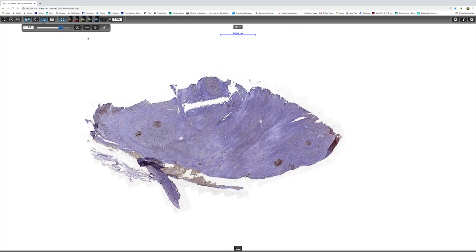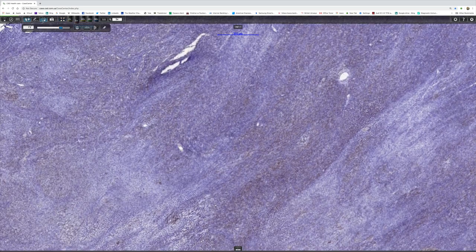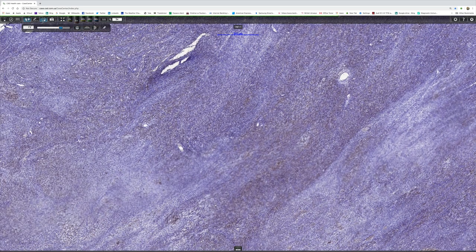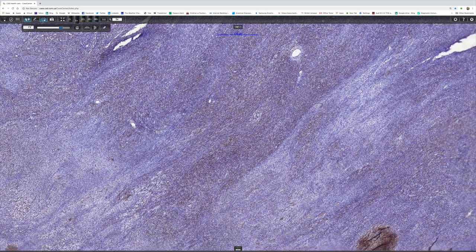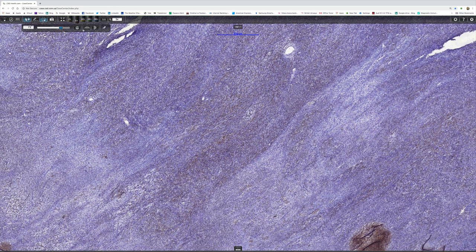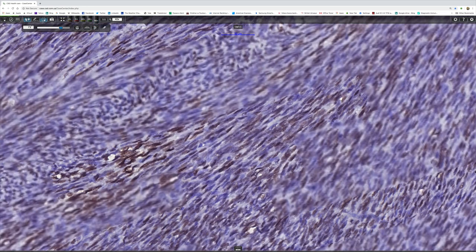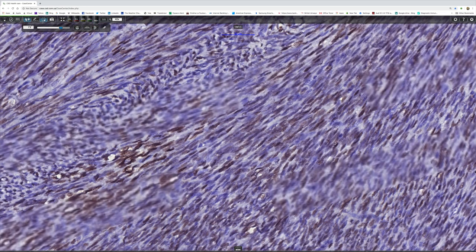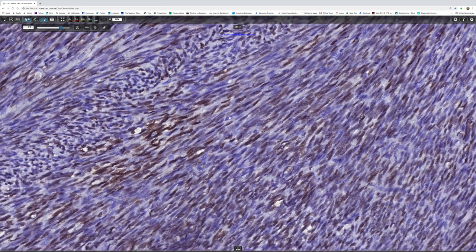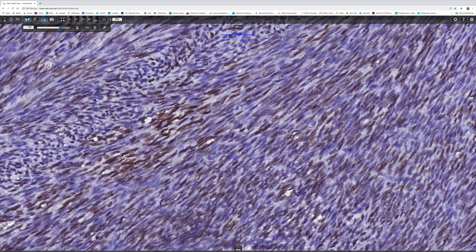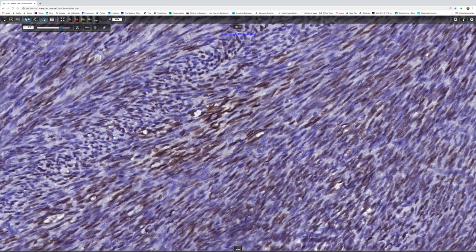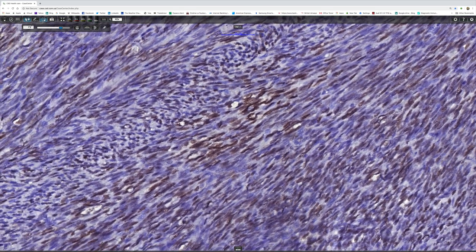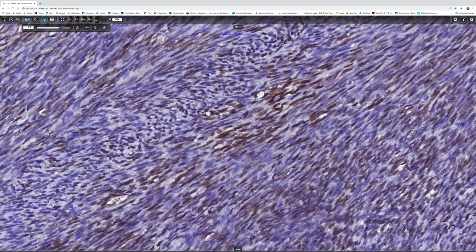TLE is not diagnostic of synovial sarcoma, but it's pretty close. So when you add the EMA and the TLE, I think one can be pretty happy that this is a synovial sarcoma.